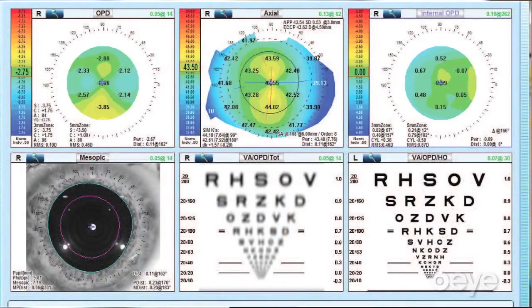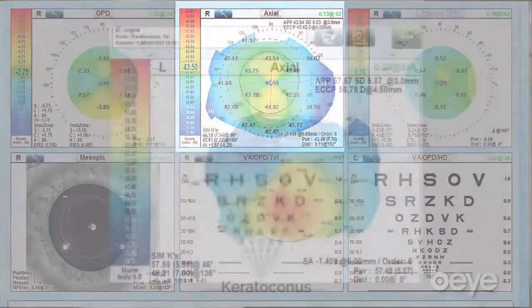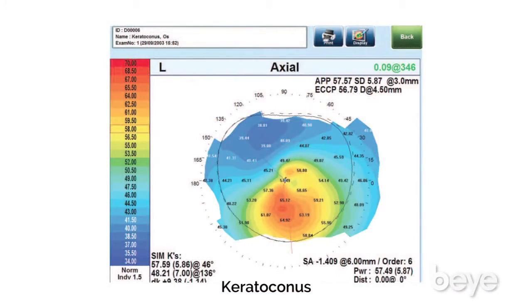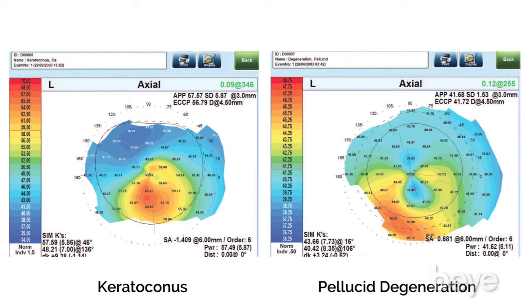The next thing I look at is the axial map, which tells me the amount, the location, and the pattern of the anterior corneal astigmatism. If it's a very irregular astigmatism pattern — if it's a keratoconus pattern or pellucid — then that patient may not be an ideal candidate for a toric implant. On the other hand, if it's a beautiful bow tie pattern, then that patient is a perfect candidate for a toric implant.